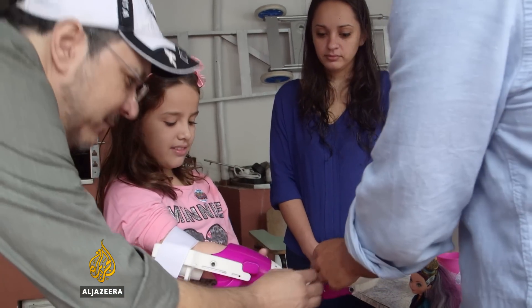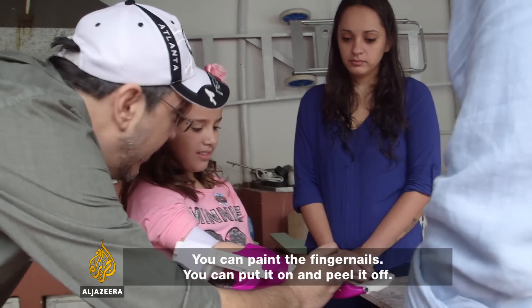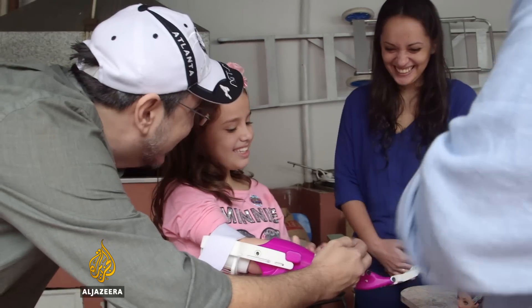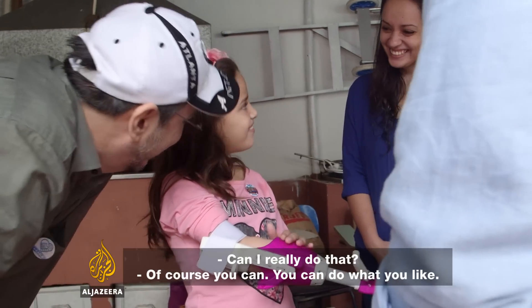You can put a nail here, paint the nail, and put it on. She liked that idea — look at her face. It's going to be really cool.